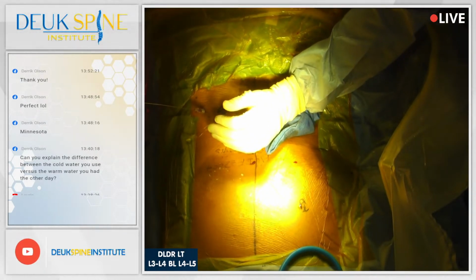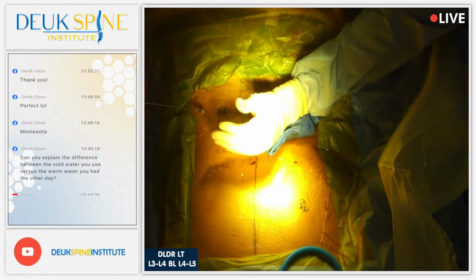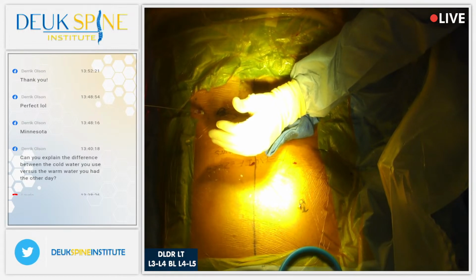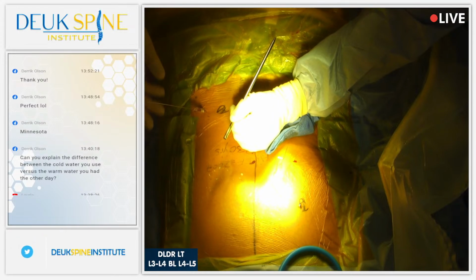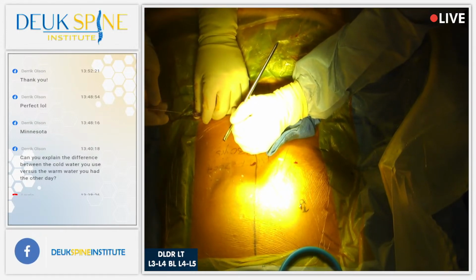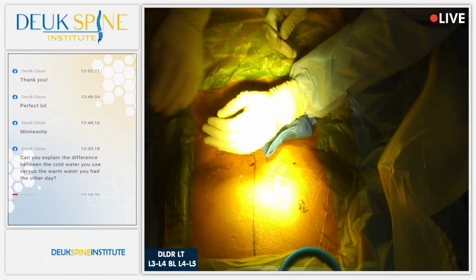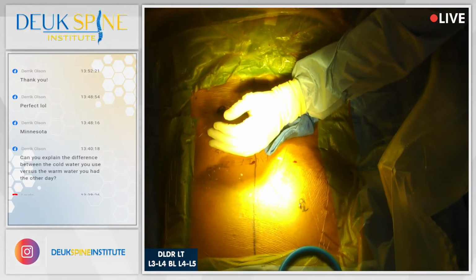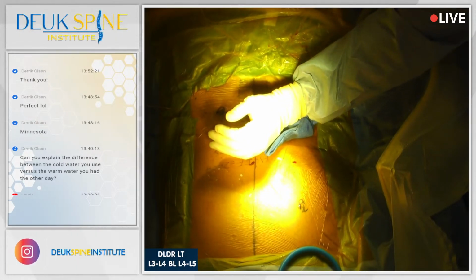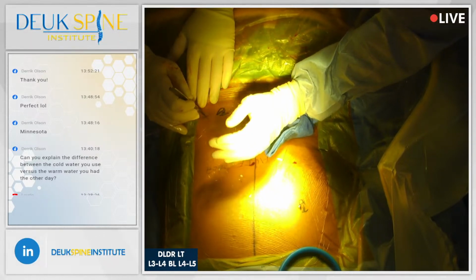This is our last disc we're going to be fixing. I need to see the front of the spine. As soon as I'm getting close to being done, let's call Dr. Patel. Guys, ladies, nurses? Skin knife? Not yet. I said as soon as I'm close to being done. That's all right. You guys have a lot on your mind.